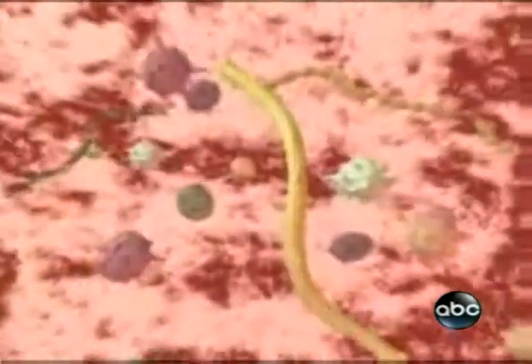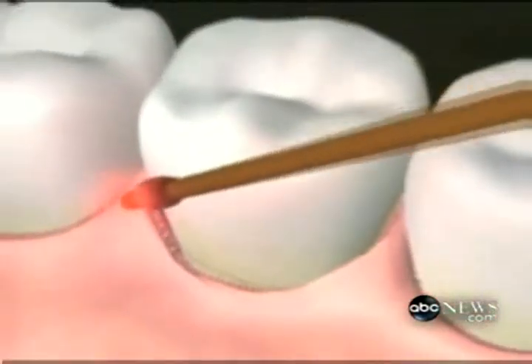use sutures. About half of the mouth is treated at a given point in time, and then 1 week later the other half is treated. Two-hour visits. So what would be the alternative? For example, it sounds like a lot of people today are already going through, as you said, cutting scalpels and stitches. What does that entail? So how much more of a benefit and improvement will this be?